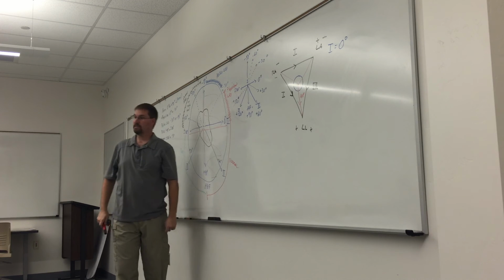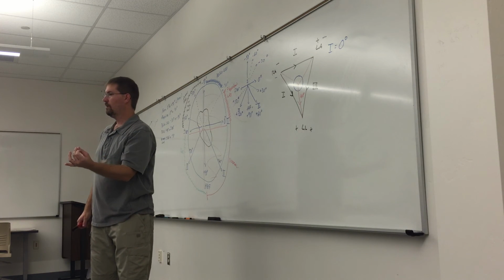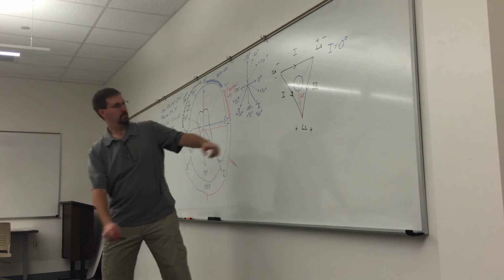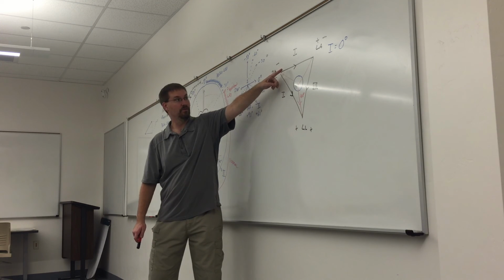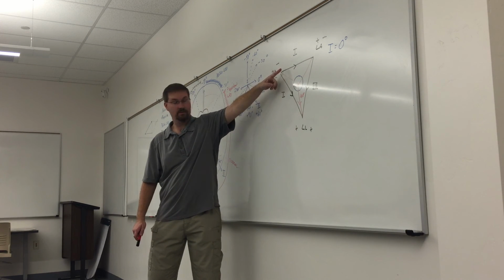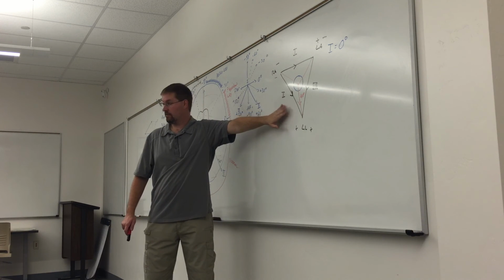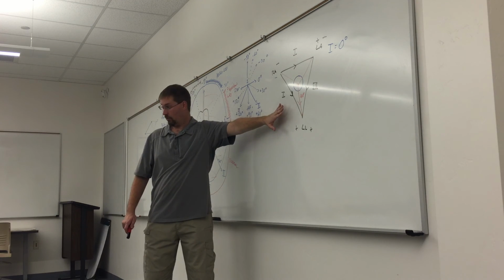And now I'm going to ask myself, is the QRS moving toward the positive electrode or away from the positive electrode? So the positive electrode over there is down. And the deflection is down. So that means moving to positive? The negative. Okay, that makes sense. See here? Away from the positive. That's why I wanted to review Einthoven's triangle first. So you guys are cool?